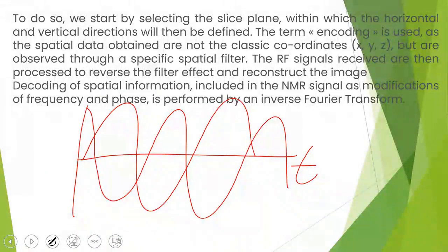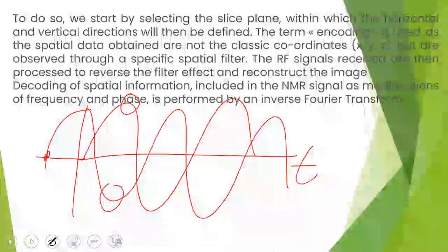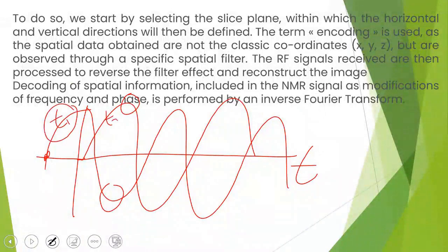So, if these two signals are in different time frames, when I receive a signal at one time, and then another signal comes in at a different time, you will find that this signal starts here. This signal started first, and then this signal follows. So, you have the different time signals of this signal, and I call this the idea of out of phase. What does out of phase mean? It means that the signal you receive might come at the same frequency, but differ in timing.